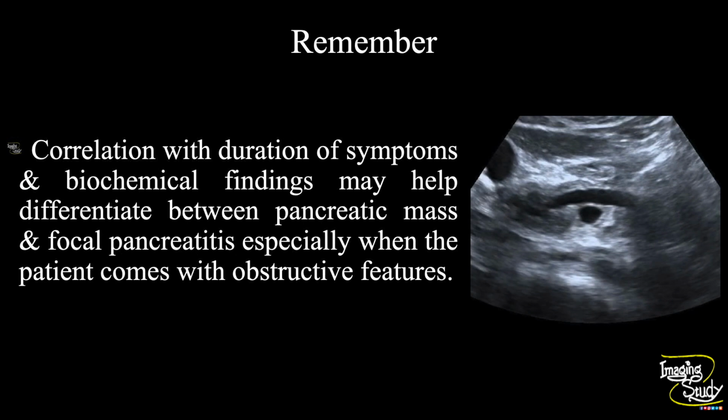Now the take-home message. Correlation with the duration of symptoms and biochemical findings may help differentiate between the pancreatic mass and the focal pancreatitis, especially when the patient comes with obstructive features.